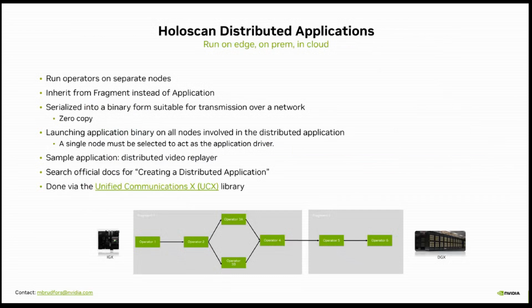And then quickly, a cool feature and one of the selling points is that you can create these collections of operators as fragments, and you can run these fragments on different nodes. So you can have one running on an IGX or a Jetson or workstation, some particular application. Say you have a photon counting CT scanner that reads data in huge amounts. You can pass that data very efficiently with some fiber Ethernet to, let's say, a DGX, some compute server that's very powerful, and do some image reconstruction, and then maybe pass it over somewhere else.